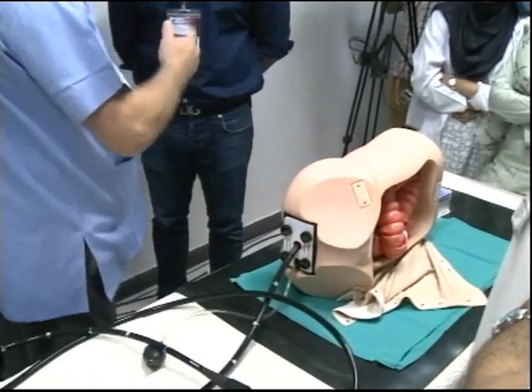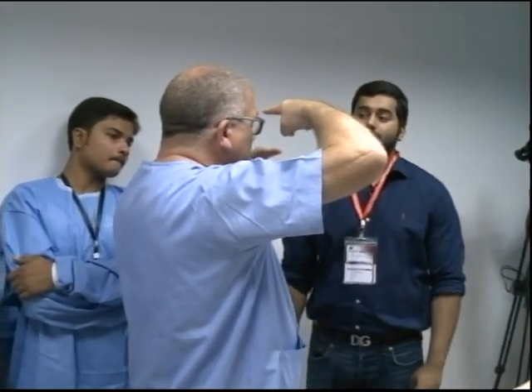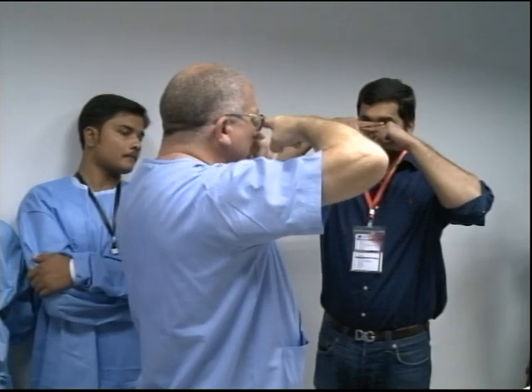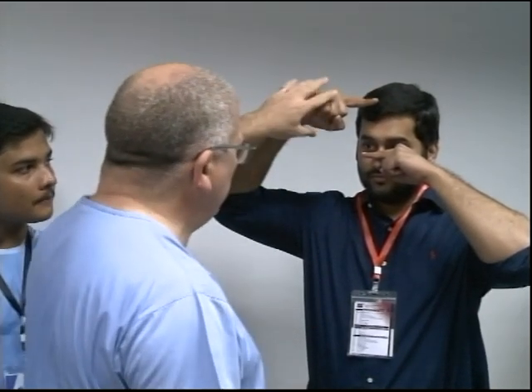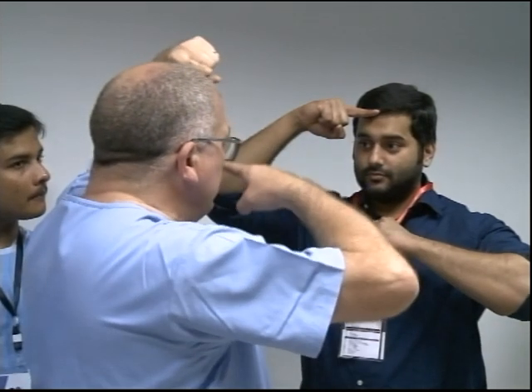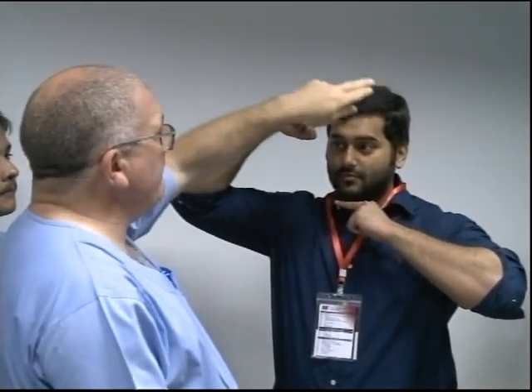So, Osama, do me a favour. Get one hand, right? This finger and this finger. Put them in your eye line. And the first one, raise it right next to your nose. And raise this one until you can't see it, but keep looking straight at me. The finger itself. Okay, that's brilliant. But close to there, that's good. Now lower this one till you can't see it. Yeah. Right. So if you look here, this is the face of the scope.